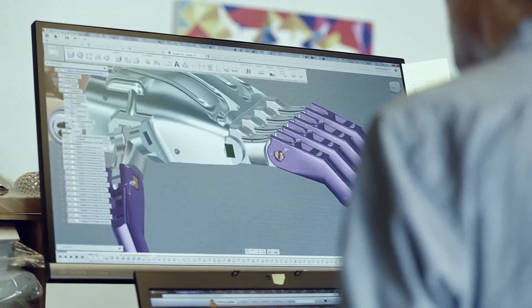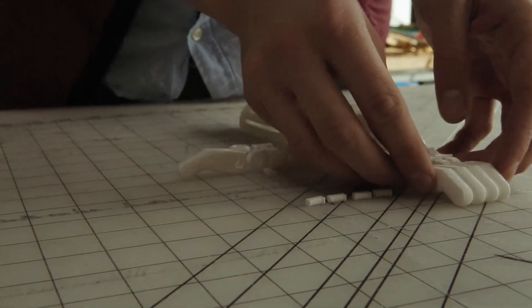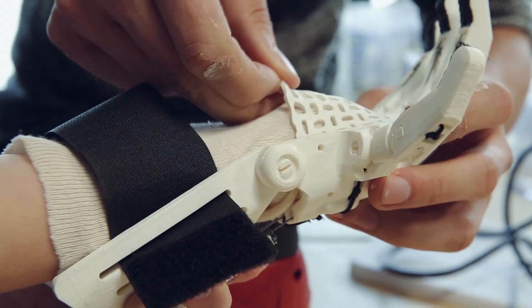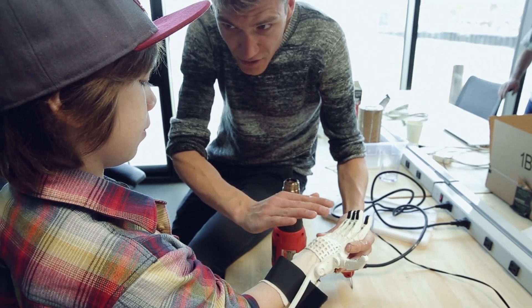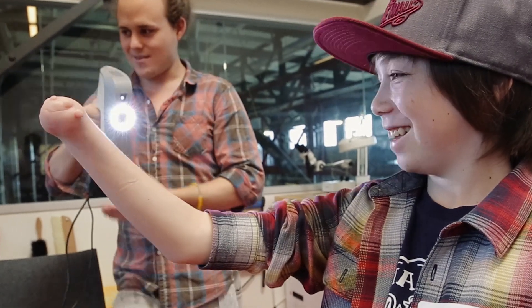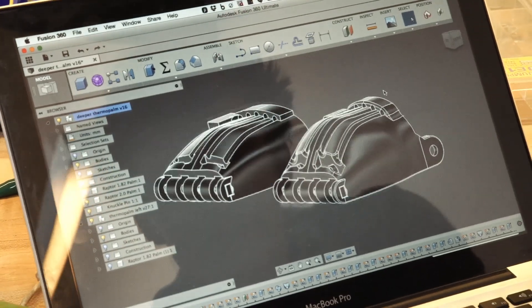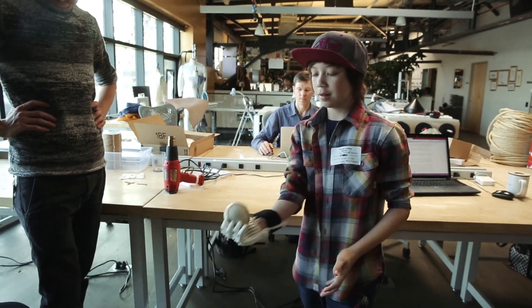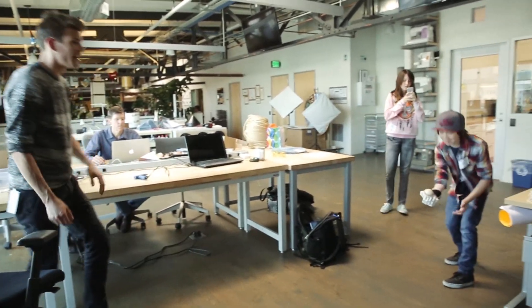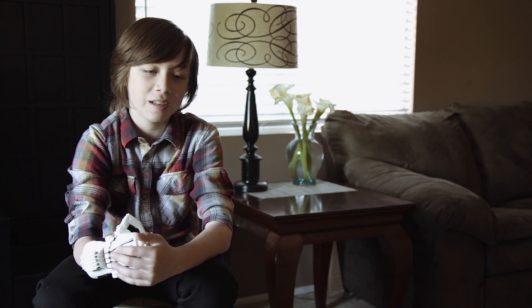It's been really great to have Kieran and his family come to Pier 9 to prototype these new ideas, to test drive these new hands, and to be able to see the higher perspective of what this is all about — to see how that hour of CAD translated into him being able to hold his coat or zip a zipper better. What Enable has done is proven that regular people can design amazing things if they're given access to the tools. I think it's pretty cool that I'm one of the people actually testing this out for a bunch of other people. It's going to be really awesome when it's so big that every kid that has a problem like me will have a hand.